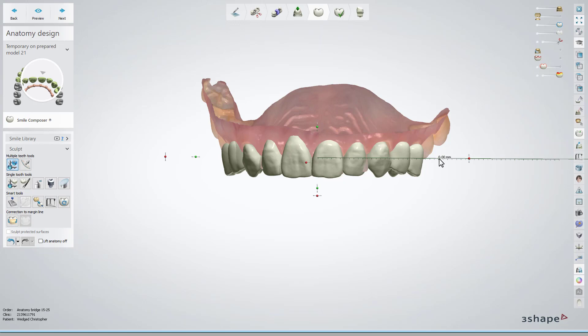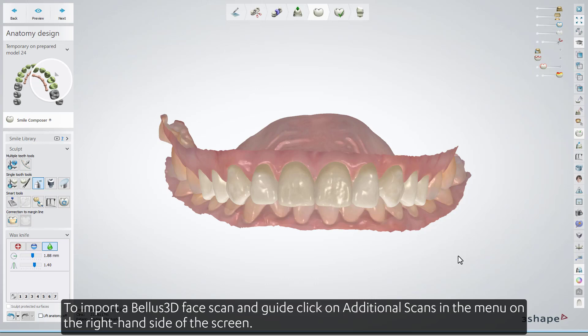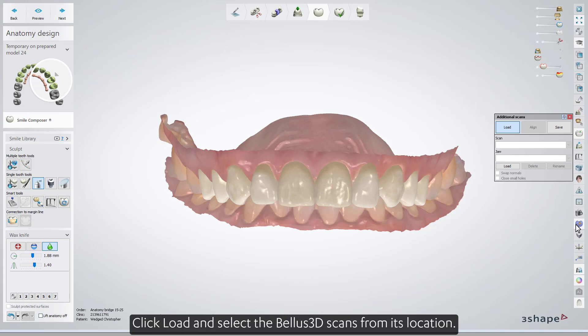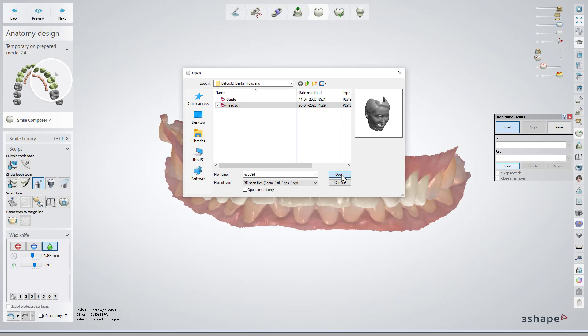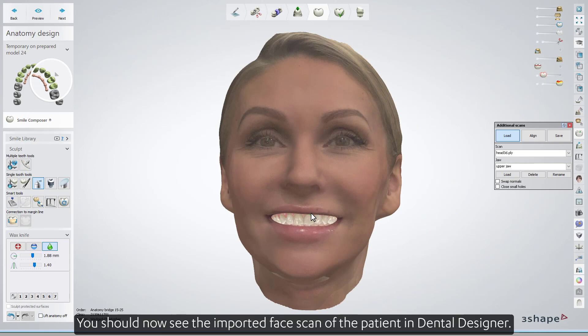To import a Bellis 3D face scan and guide, click on Additional scans in the menu on the right-hand side of the screen. Click Load and select the Bellis 3D scans from its location. You should now see the imported face scan of the patient in Dental Designer. You can do the same with the guide.